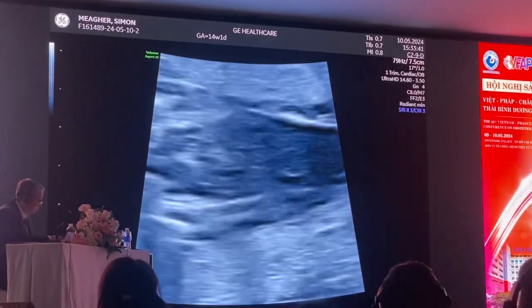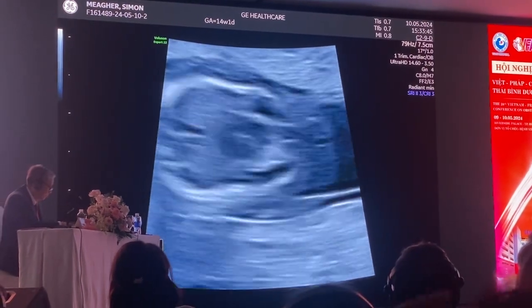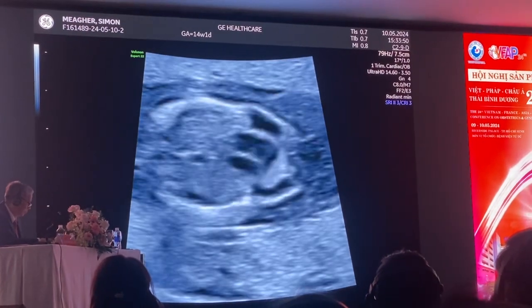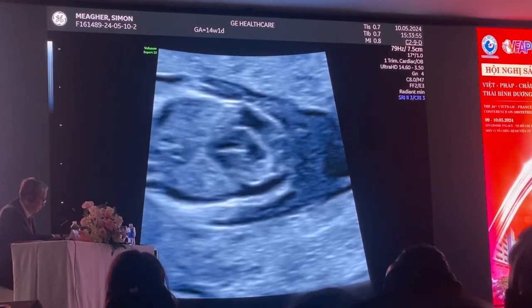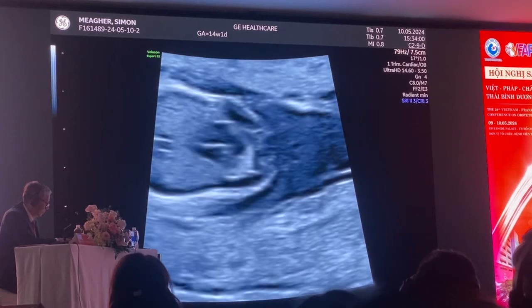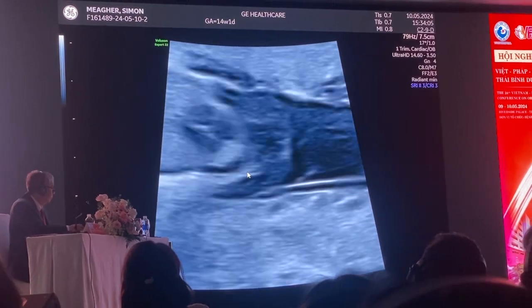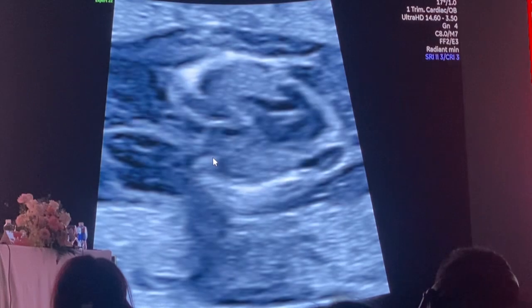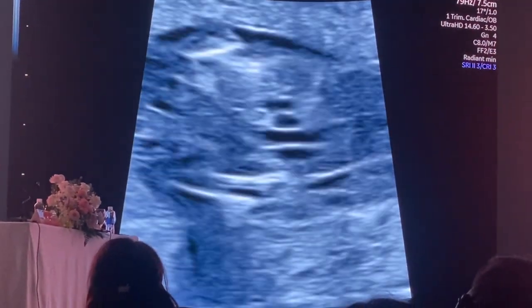Coming back to the baby's heart, looking at the baby's heart, I can see that the left and right cardiac ventricle are normal in size. I can see that the cardiac outflow tracts look normal. I can see that there's a bilateral pleural effusion, and I also think that there may be a pericardial effusion because I'm looking at the apex of the heart. I think there's actually fluid surrounding the heart as well, that the heart seems to be free. But that doesn't surprise me if that's present. But this is a normal pulmonary artery, normal aorta, and normal SVC.